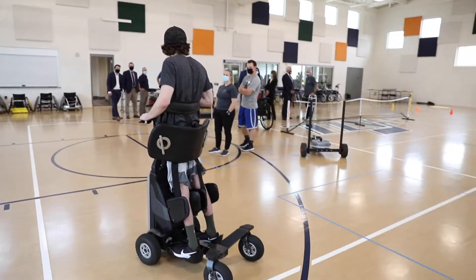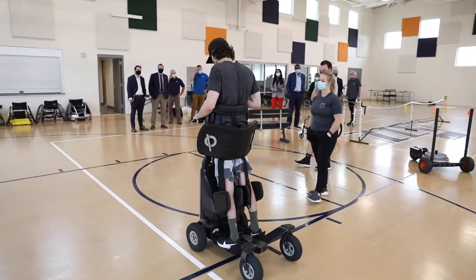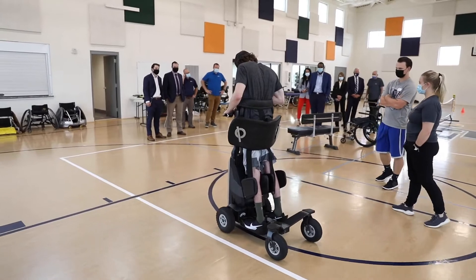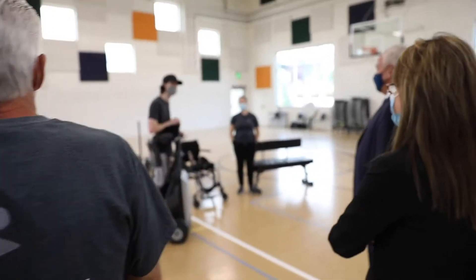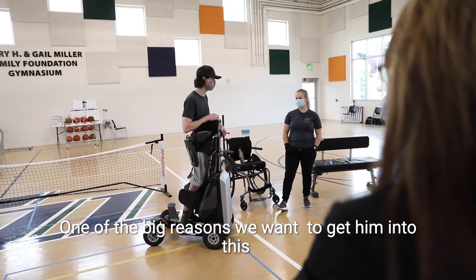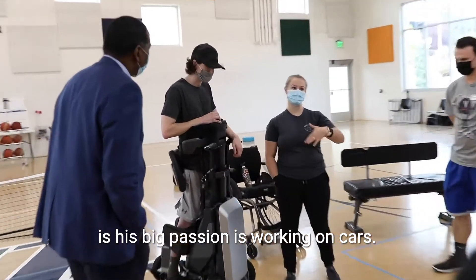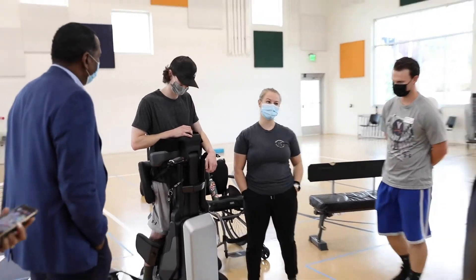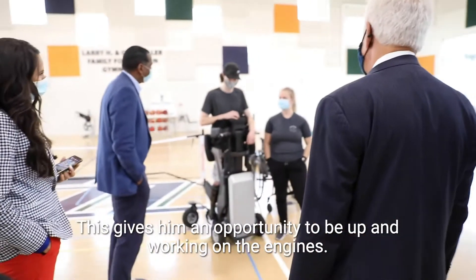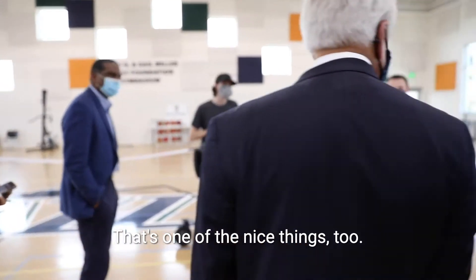I feel like I'm up and moving around with everyone. One of the big reasons he wanted to get this device is that his big task is working on cars, so this gives him an opportunity to be up and work on the engine.